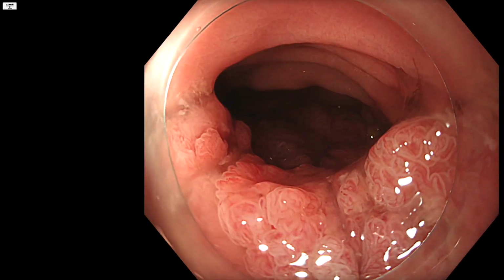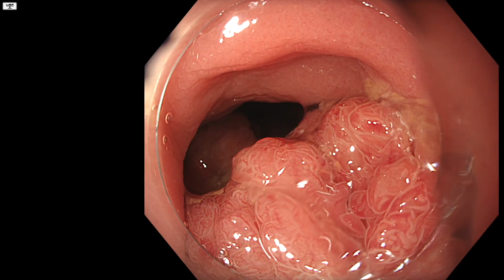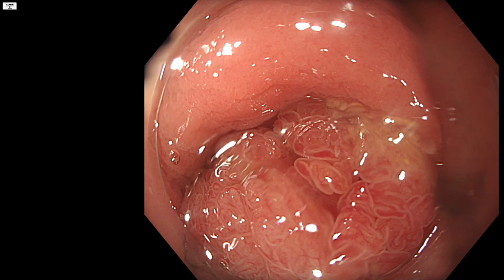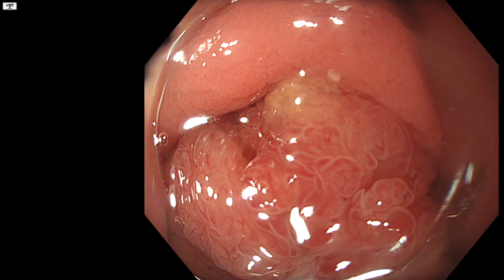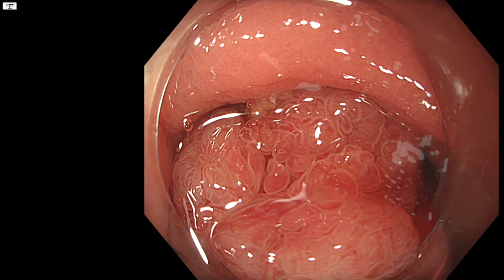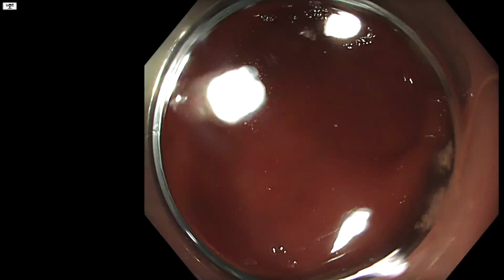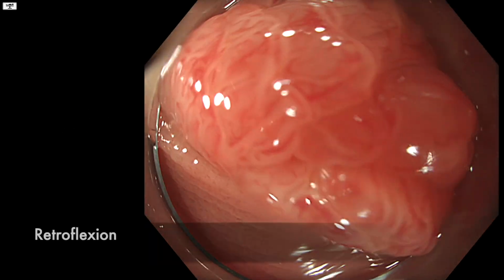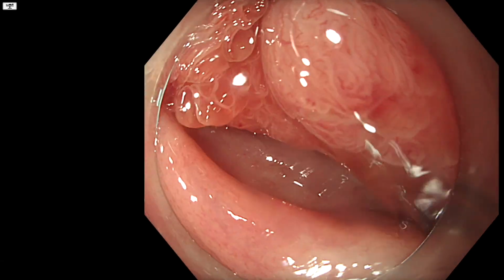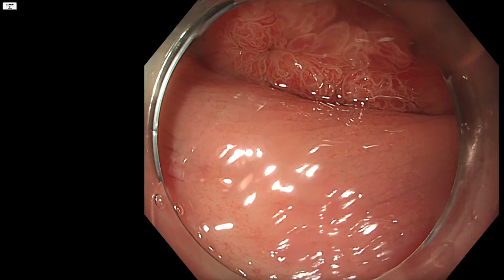Now, I have to be honest with you, I haven't done that many very complex lesions. I'm still very much in early stages of a learning curve, but when I do look back at the cases where I've really struggled, it's almost always been these very bulky LSTs. Because as many of you will know, these lesions tend to be fibrotic, they often have muscle retraction, and they're usually quite unstable, which means they keep dangling from one side to the other, and that can make dissection an absolute nightmare. But not just that, they're also very difficult to stage accurately with optical diagnosis and MRI.